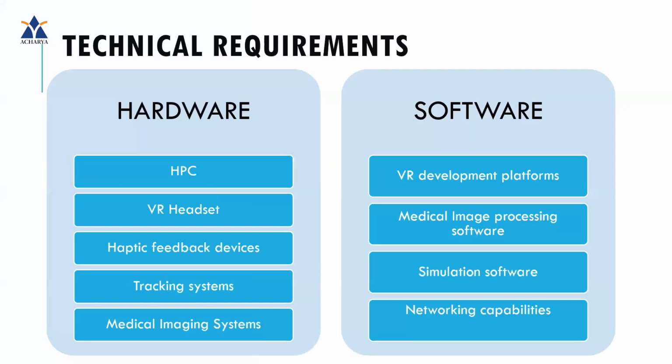Next are the technical requirements. So this is the list of hardware and software required for this simulation in interventional radiology. The first thing is a high performance computing system. You'll require a high-end GPU and a fast CPU, as well as enough storage space.